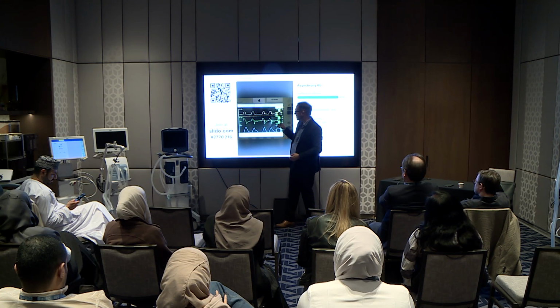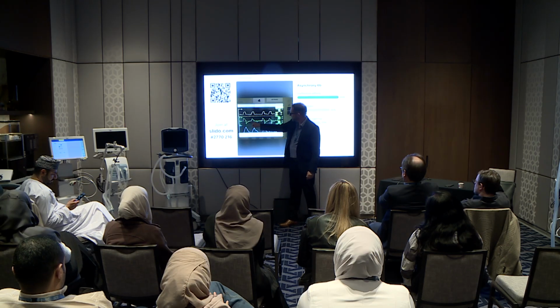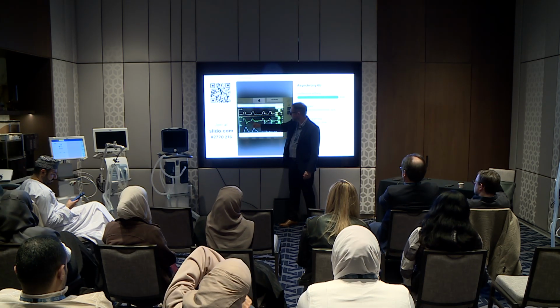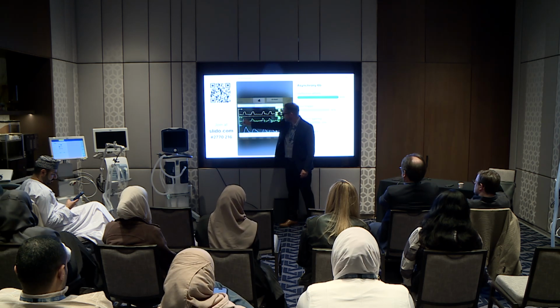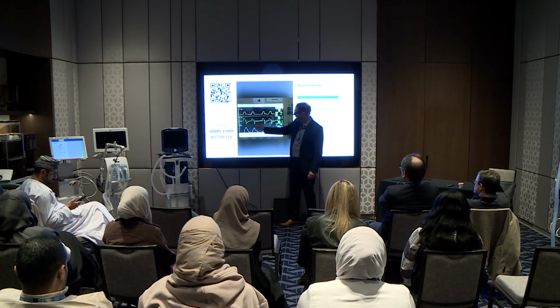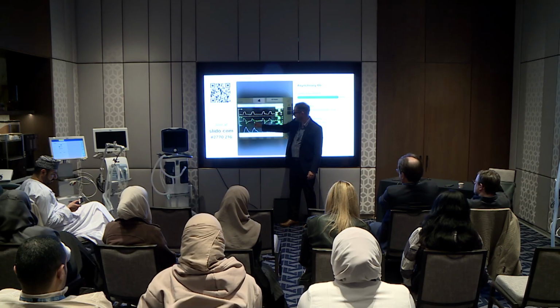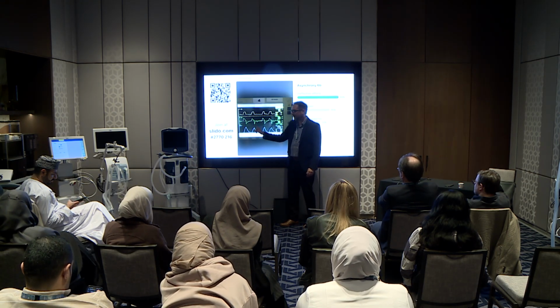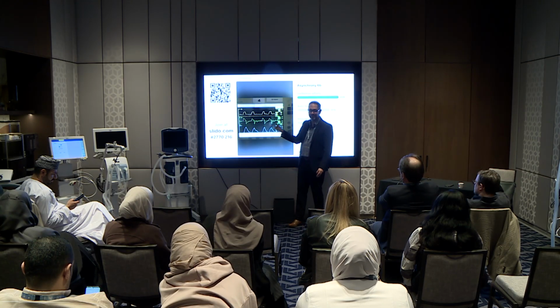So this is auto cycling, but what's happening here is that the breath was triggered likely by the auto cycling. And notice how the flow decelerates normally here, and here it's normal, but here it decelerates and then goes back up. And this blip here is actually ongoing inspiratory effort, so you have reverse triggering. The phenomenon is actually happening here and over here.